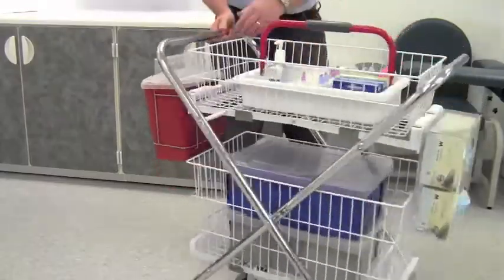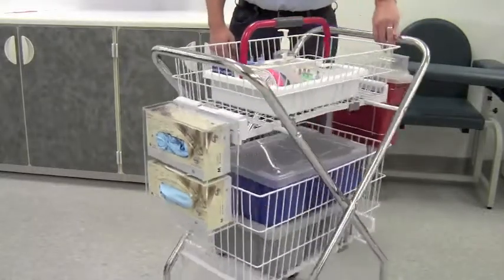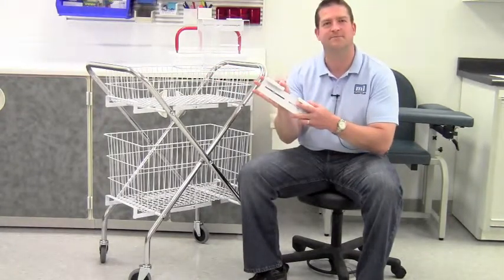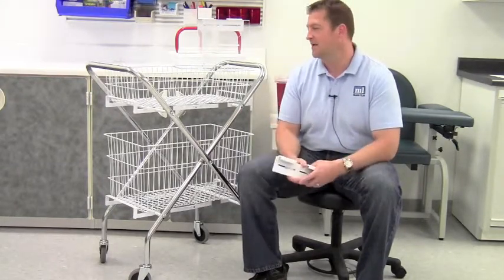Hi, I'm John from Market Lab and this is the Deluxe Wire Basket Phlebotomy Cart. We've taken this high demand cart and modified it for phlebotomists by adding our exclusive wire cart holster. The wire cart holster allows you to mount accessories on the outside that you need to access repeatedly, and frees up space on the inside.